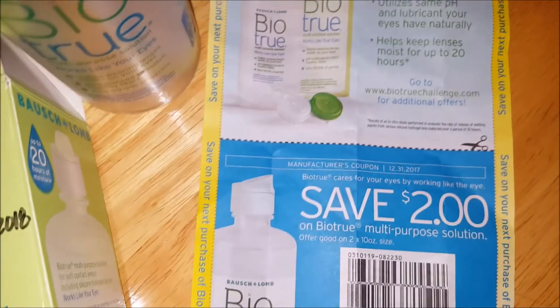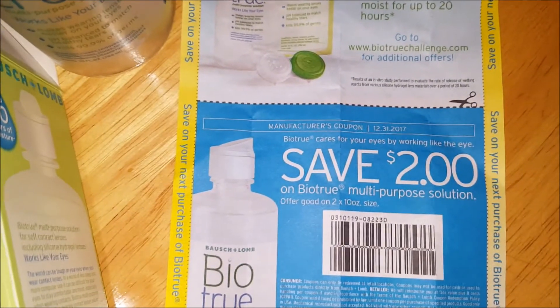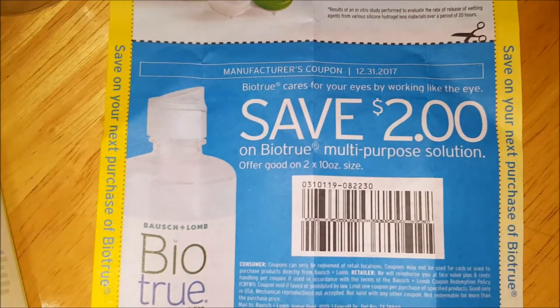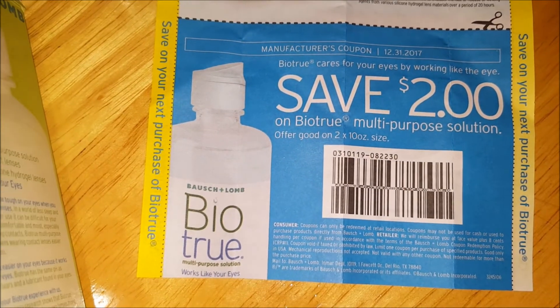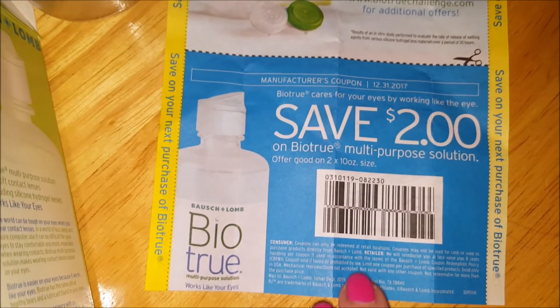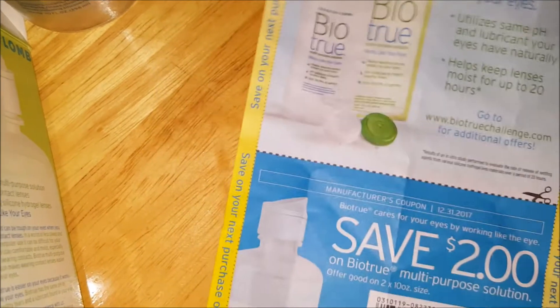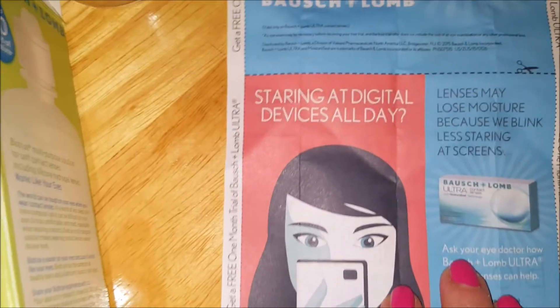Another thing I like about this is that ever since I've been buying it, the bottles come with a coupon inside. I didn't use this one before it expired, so that was my mistake. I'm not sure if the ones I'm buying now will have the two-dollar coupon, but it certainly did help when I was able to use it.